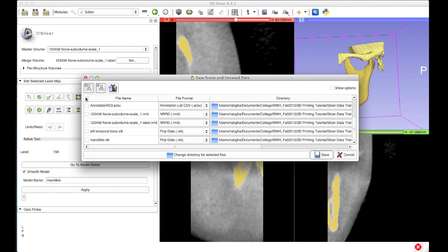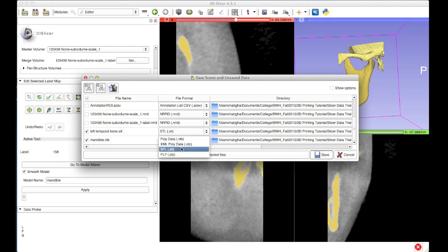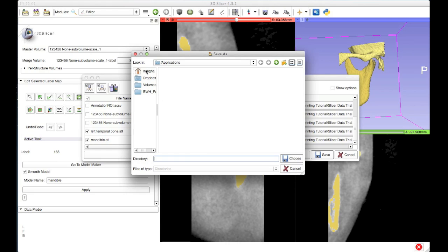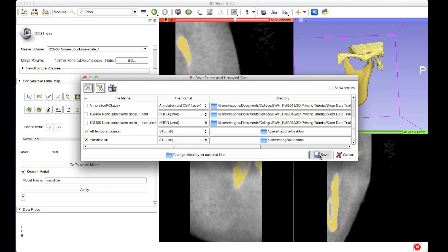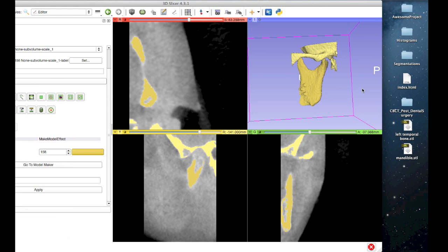I'm going to use the select all option to select all this information, then deselect all of it so that I can pick just the two surface models. The file format that's most convenient for me is STL, but you can of course choose whichever format is most convenient for you. Then I'm going to click change directory for selected files, which enables me to change the save location for all selected pieces at once. I'll choose my desktop for convenience and hit save. So I'm going to move my Slicer window and check my desktop — sure enough, there are my temporal and mandible surface models saved as STL files. This is the information I'll use with my 3D printer.